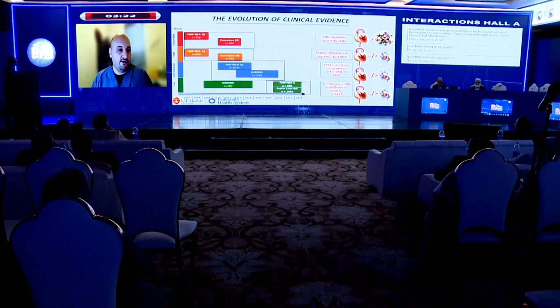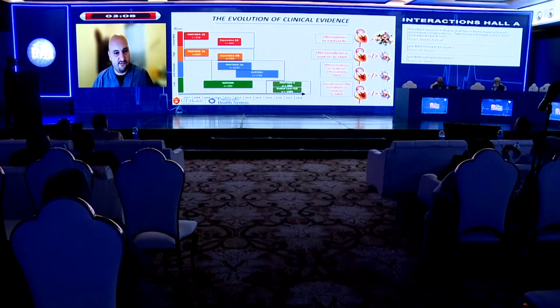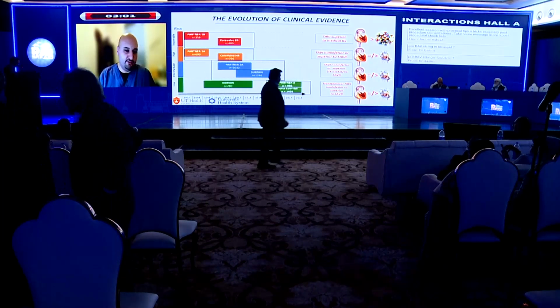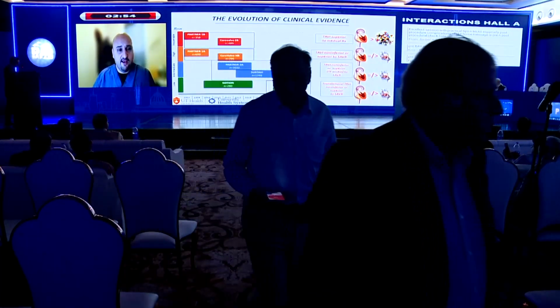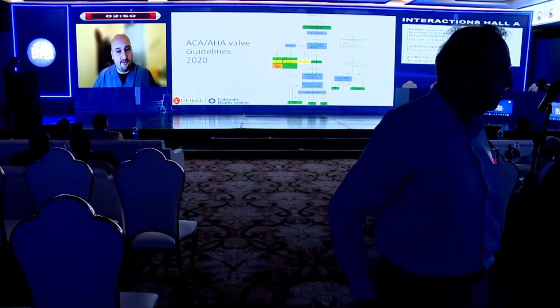Now we can wonder why the low risk separation was more obvious, with maybe a little better performance with TAVR. This can be attributed to multiple things, including gaining operator experience, better ways to size your valves using CT scans, and newer generation valves. And if you took these back and maybe redid the intermediate risk or the high risk trial, you might see separation of the curves like you see in the low risk trial. So a lot of work has been done in this field in terms of improving and streamlining the procedure.